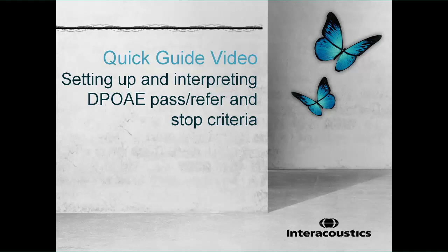This quick guide video provides an overview of setting up and interpreting DPOAE Pass, Refer, and Stop criteria.